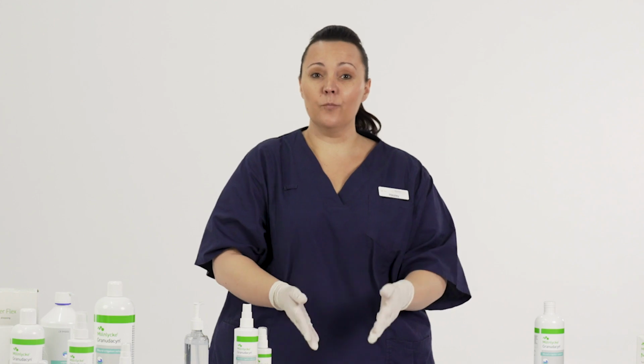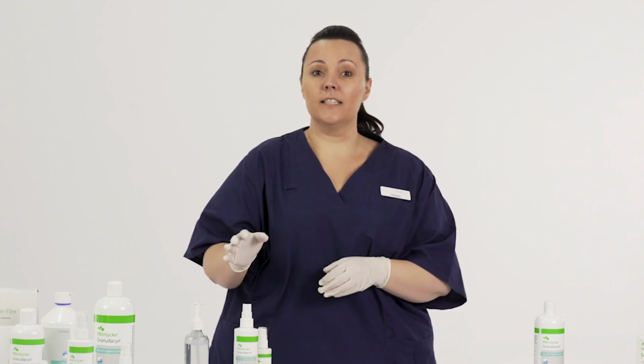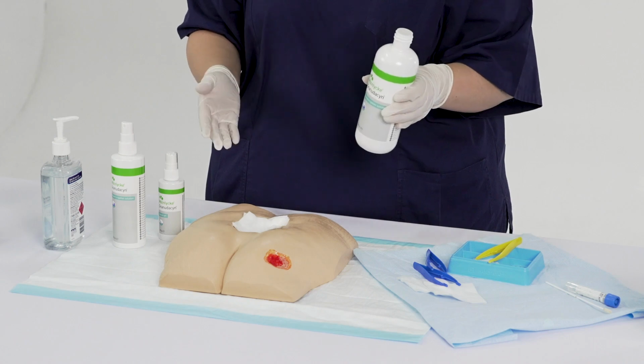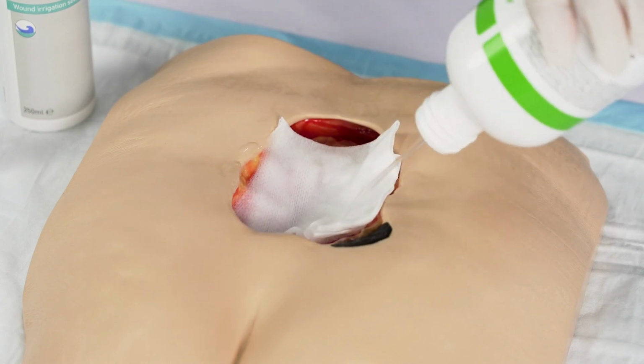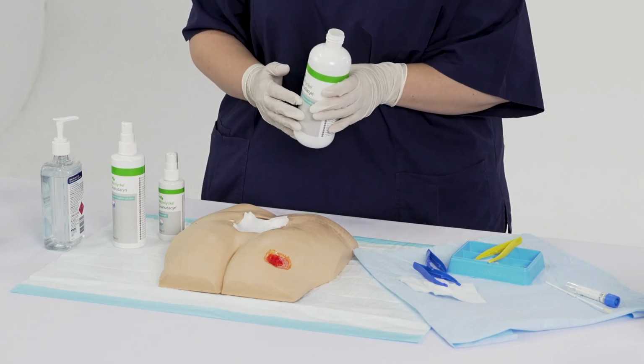If you have a cavity wound with thick, tenacious slough, you may opt to use the Granudacyn by soaking the gauze and applying it to the wound. So to soak the wound, I've applied some gauze to the cavity. I'll now drench the product over the top using the Granudacyn product and allow it to sit there for whatever time is required based on your clinical judgment.